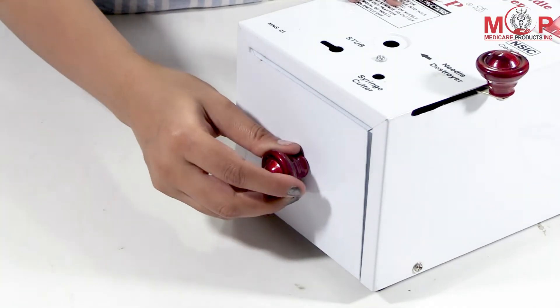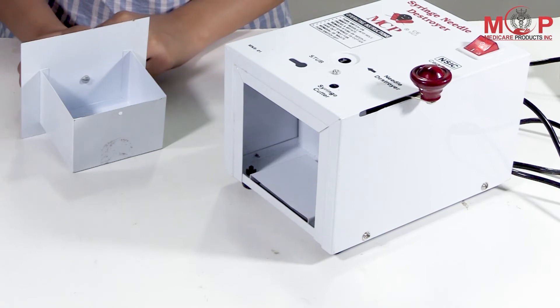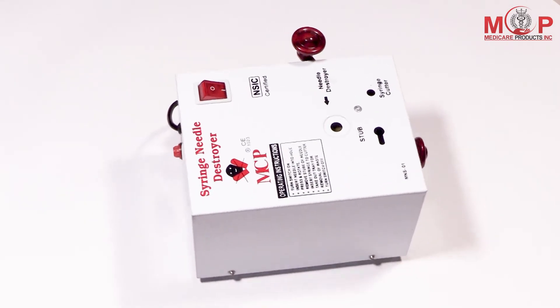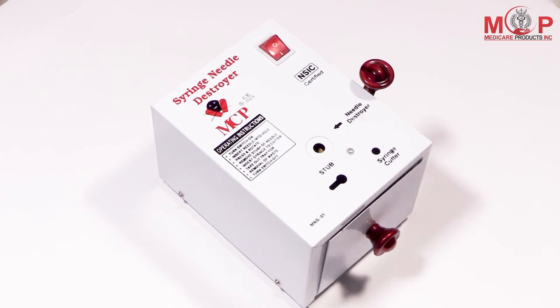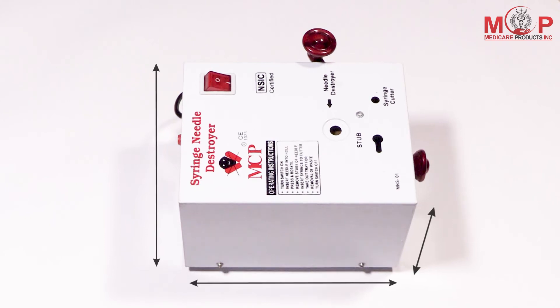All the wastage will be collected in the waste box, which has a capacity of around 350 ml. The MCP MNS-01 Needle Destroyer has a strong metal body with powder coating for long life. Note: the cutter is suitable for 18 to 28 gauge syringes only.